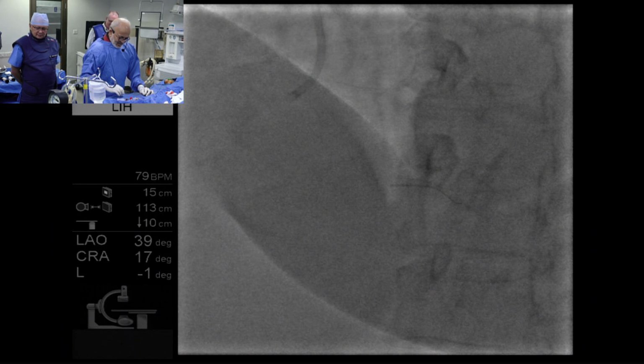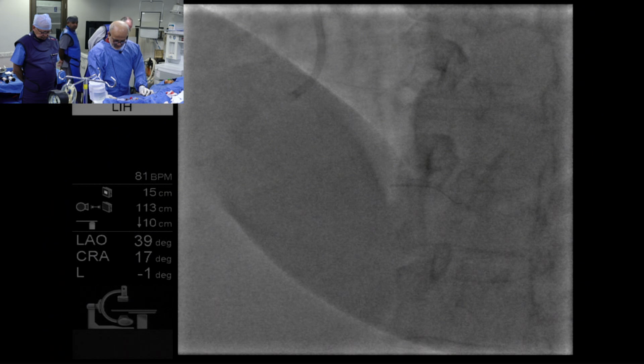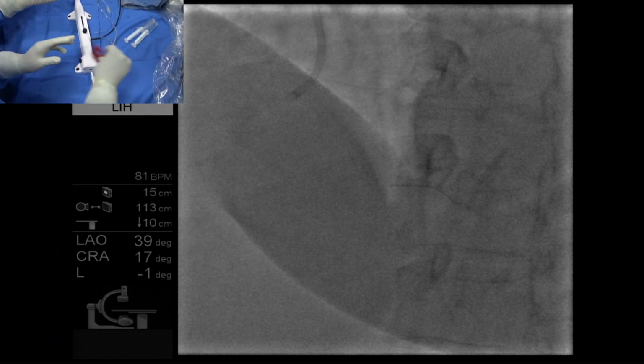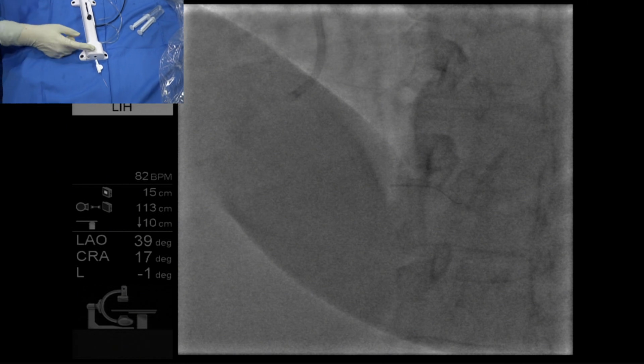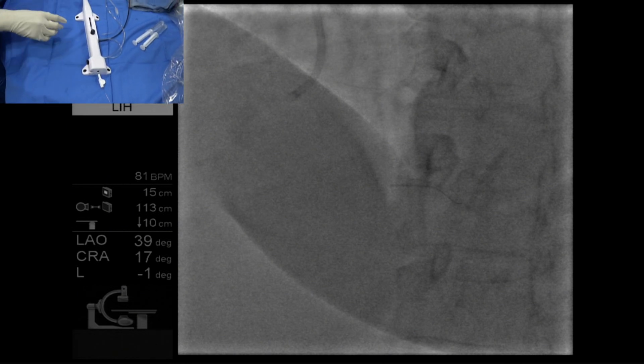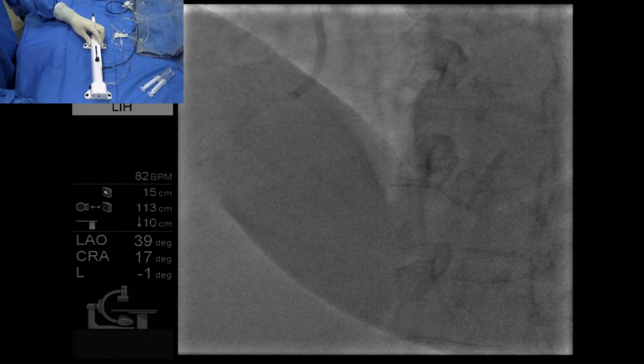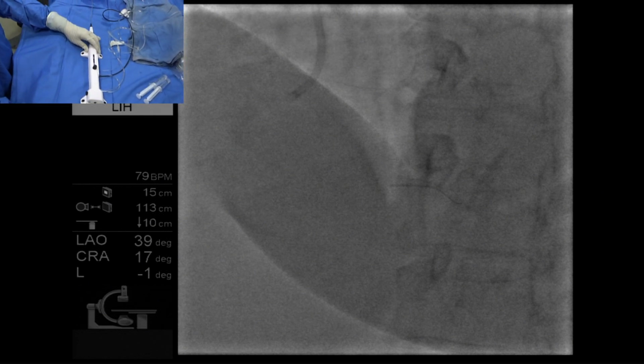Now we are testing. I need a pint. Flushing? Flushing, yes. Bring it a little more proximal. Sanjay, you are having the brake there, right? Yes. Just open the brake and make it a little straight.